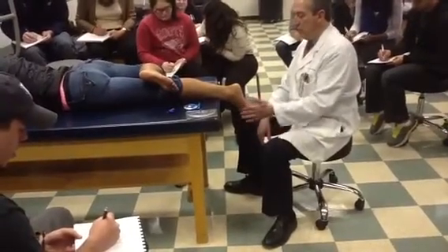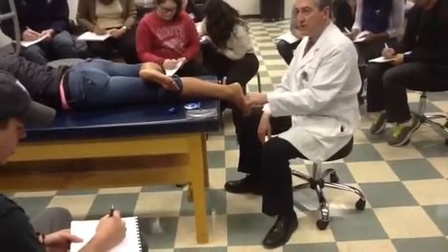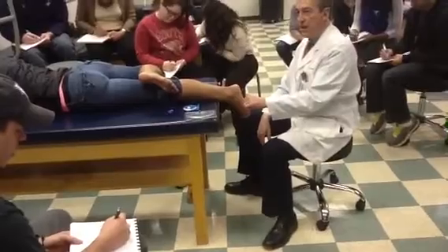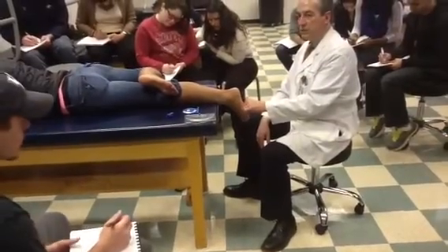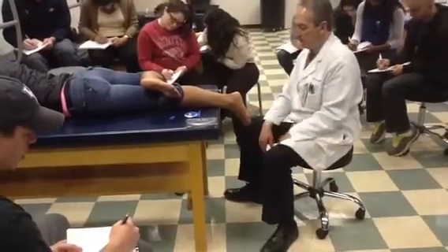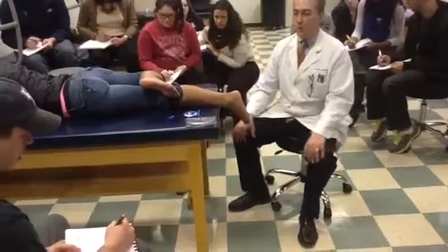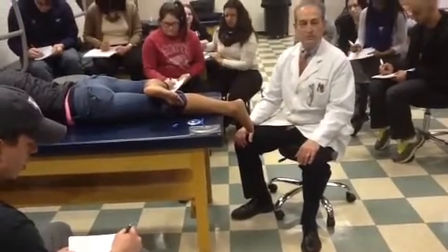Which means we have to load the lateral column, right, to maximally dorsiflex, abduct, and evert the forefoot relative to the rear foot with the subtalar joint in neutral. Now, what are our reference lines when we look at the forefoot to rear foot relationship?